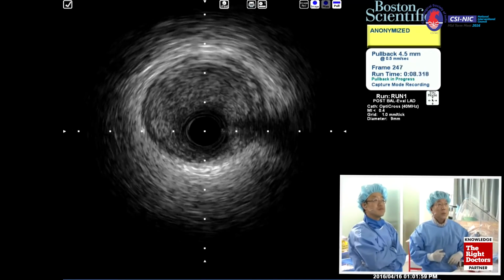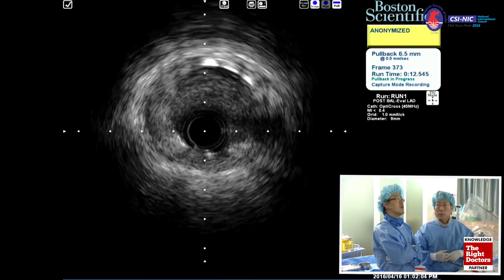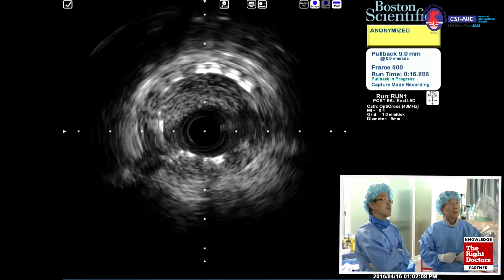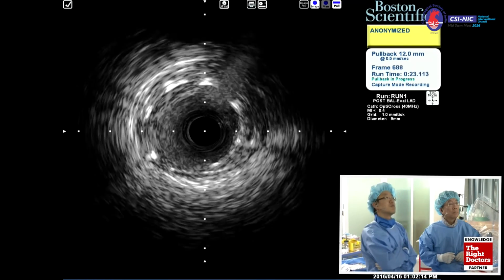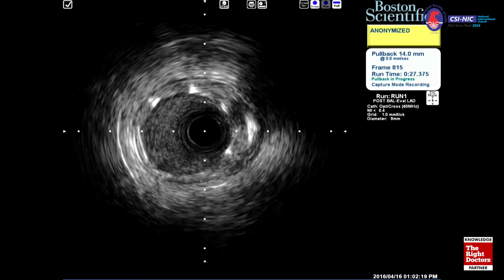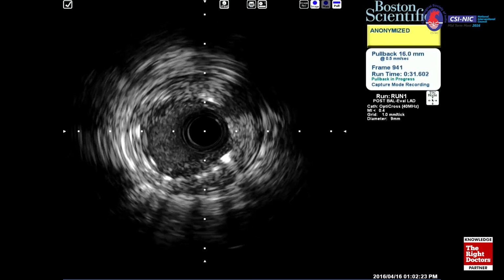So, Pyong Lee, would you read the IVUS finding? You can see the distal part of the previous stent, and there are lots of in-stent restenotic plaques. You can see that at 9 and 12 o'clock. And this is the mid portion, I think, of the LAD. The stent diameter is about 2.8.